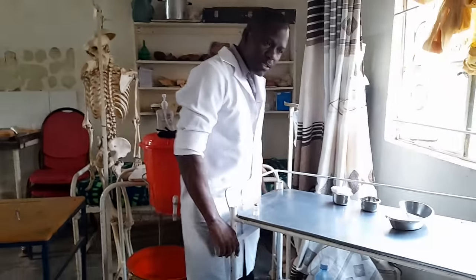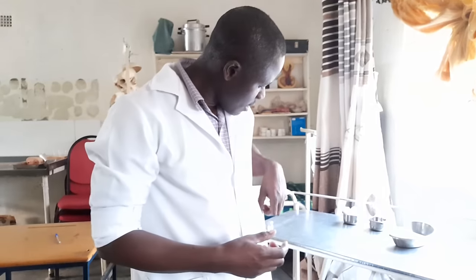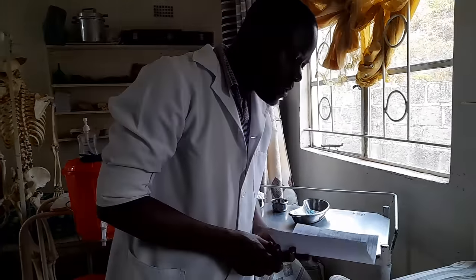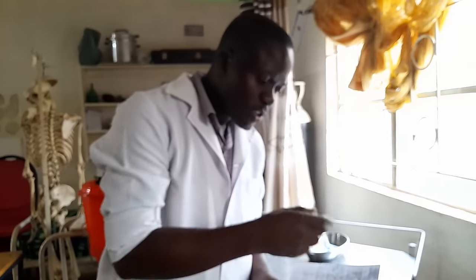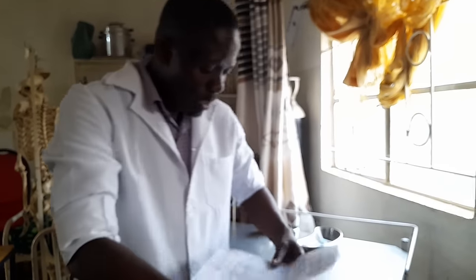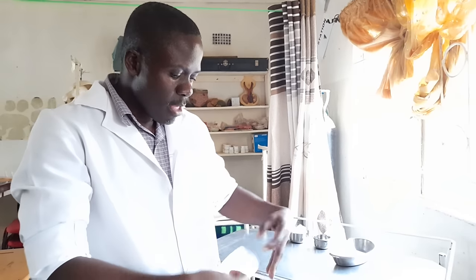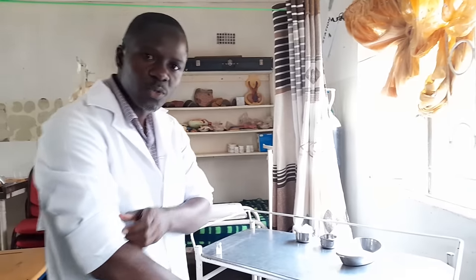Before the second hand wash, there is the point of verification — you should verify three times. So you verify again here on the drug chart and then go to the patient: 'What did you say your name is, sir?' The patient answers that he is Mr. Luwoya. So I've verified again. Then before injecting, I verify once more, ensuring it's at least three times total.